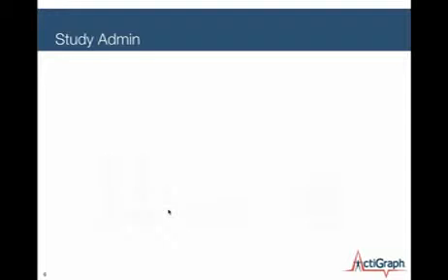We've had several webinars concerning our study admin system. We've had a lot of marketing material produced. And so I wanted to just take a minute and review the study admin system for those of you who are new to it or this is the first time you're hearing this terminology. I thought it would be helpful to just cover what it is we're talking about here.